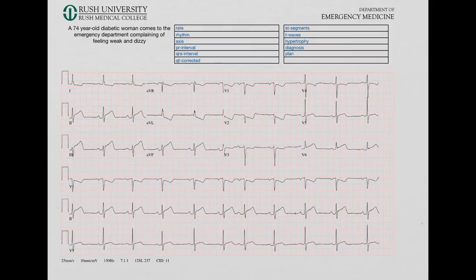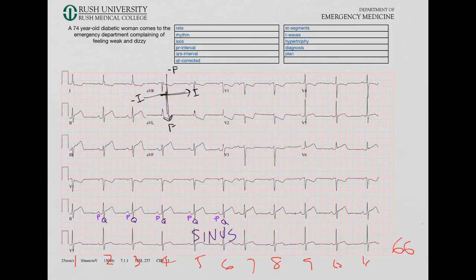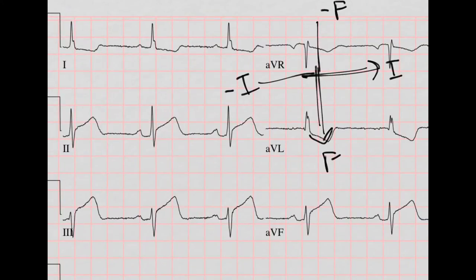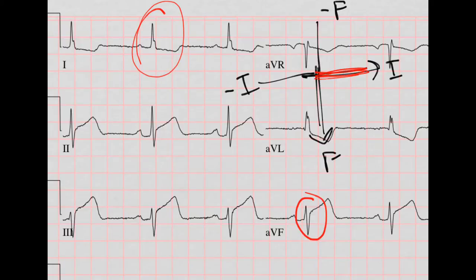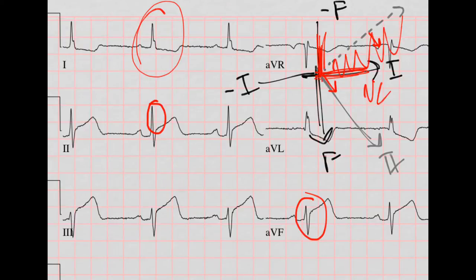Let's go to the next EKG. Let's start with rate: counting 1 through 11 QRS complexes — the rate is 66. For rhythm, there seems to be a P for every QRS and a QRS for every P, so let's call this sinus. Now let's do axis. Lead 1 is mostly positive, and F is mostly negative. Looking at lead 2, it's more positive than negative, so we're on this side of the line — we've got normal axis.